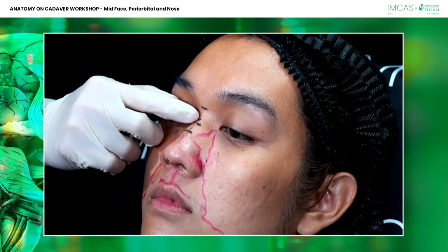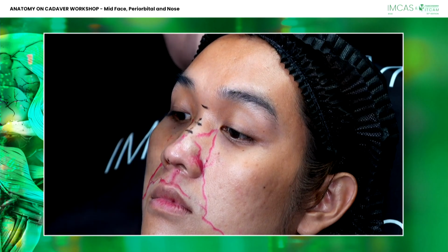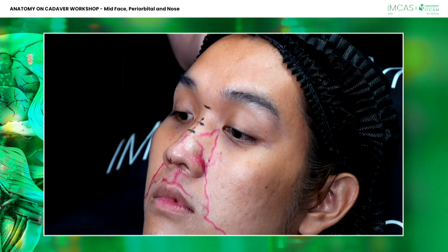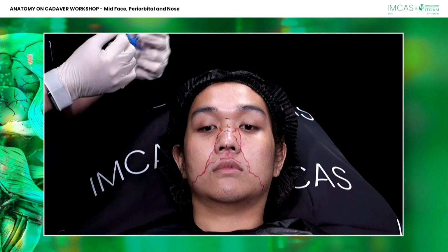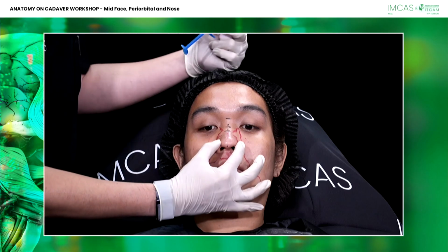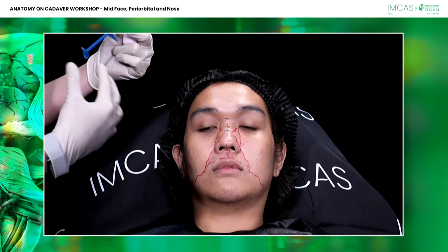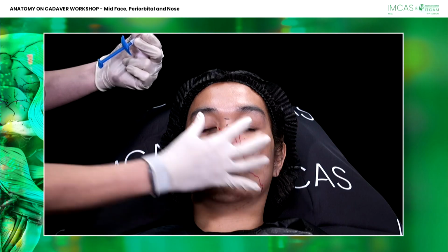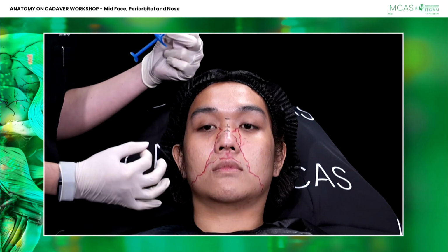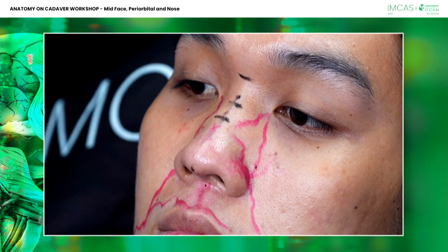And I mark here that is for the needle injection. Actually, needle injection is not 100% safe. You need to be careful to do the aspiration effectively, and I'm going to show you it's around 10 to 13 seconds. But for the tip of the nose and the lower part of the nose, this reminds me that this area has a plexus of the vascular area. So in this area, I prefer to use the cannula, a big cannula like a 22G cannula.